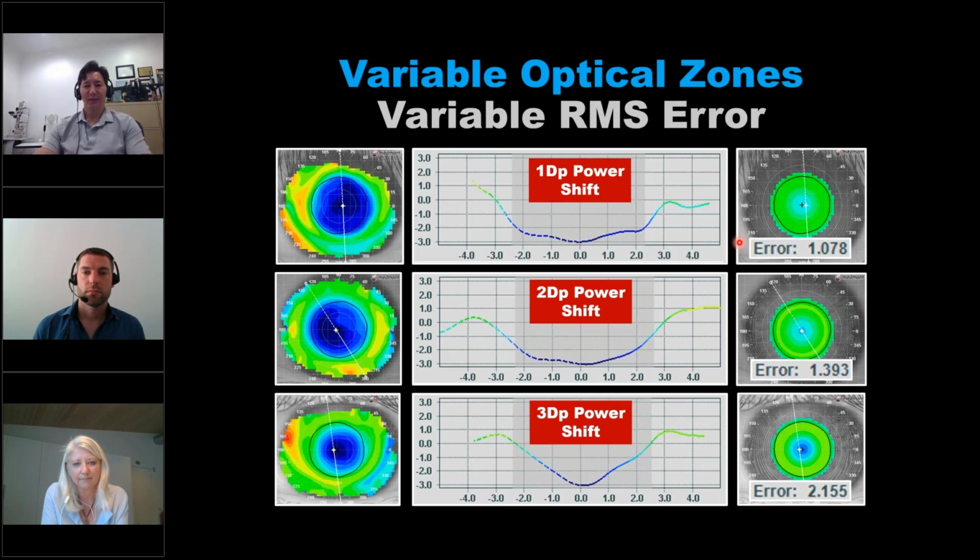So if we're trying to give a patient a high add within the pupil, we're increasing the aberration. So while we might provide better multifocality, are we increasing the high order aberration such that the two are kind of neutralizing each other and we don't have a really great visual gain? Anyway, that was one consideration, but an exciting area certainly for orthokeratology.